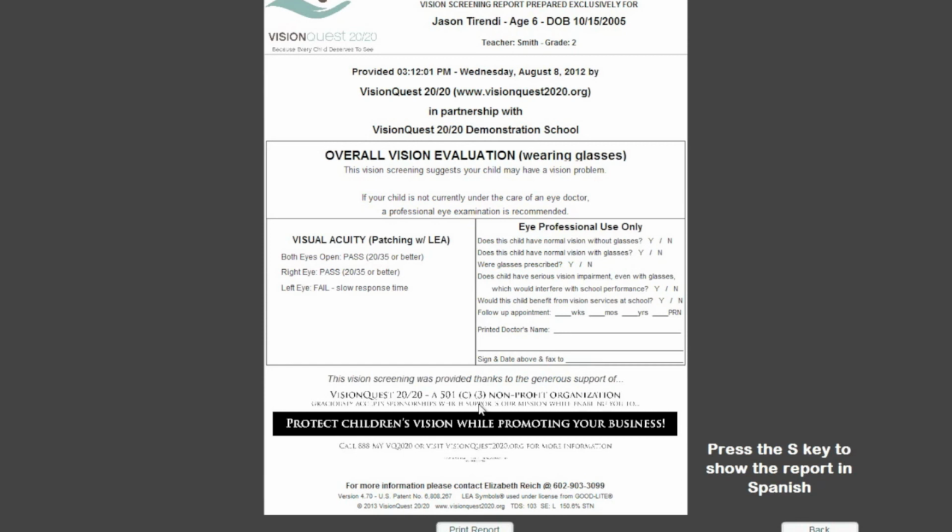The short answer is that at any point in time, for example, we've got some schools that use Macintosh computers. And so the way that they do their vision screenings is they actually borrow PCs and conduct all of their vision screenings, and then they contact me subsequently and they say, Rich, we need all of our reports, because they're not looking for the aggregate data reports that I showed you on the web. They're looking for the individual screening reports.